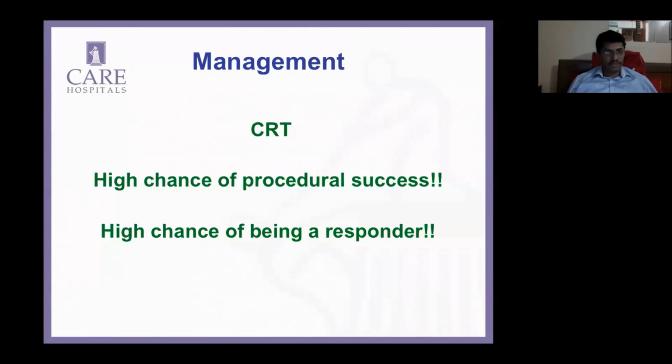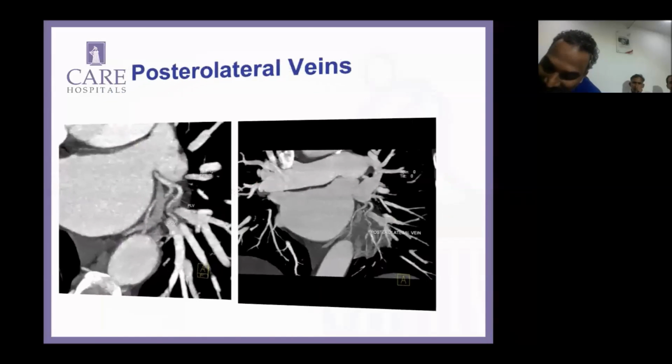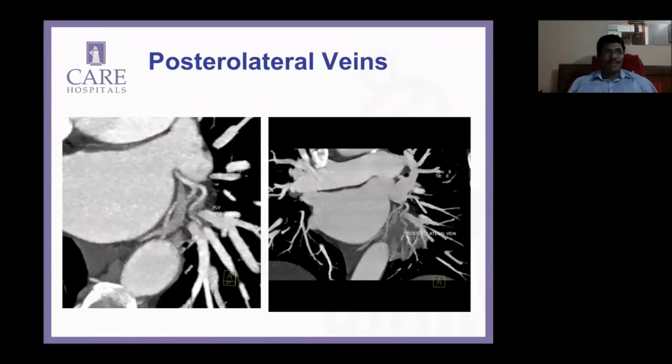Over to you, Sharad. Yeah, I mean, this is a nice case, sir. It's an eye-opener for me. So wherever I send a patient for CRT, I mean, I have to take a long injection of angiogram. So far, I'm not doing that. I don't know how many people are like me in our participants. You're not worried about the EP guys getting all the radiation, that's why.